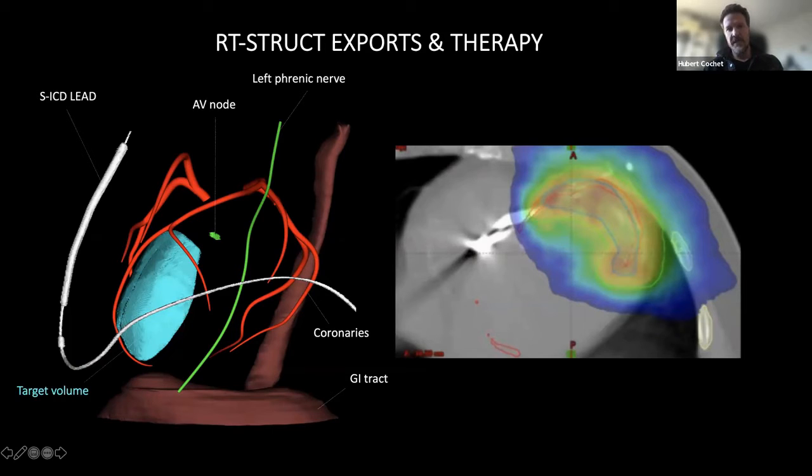We've been doing that in about 50 cases in multiple sites. In fact, the Brigham is the most active site. They've been doing 10 to 15 cases with our technology. And it's very variable. Of course, for now, it's a last resort technique that is used in the context of compassionate use. Very rarely, but sometimes we only have imaging because the patient has two mechanical valves. It's impossible to access the LV.